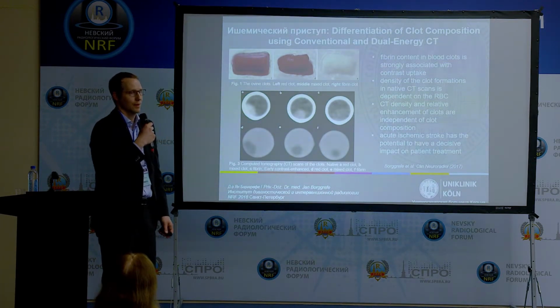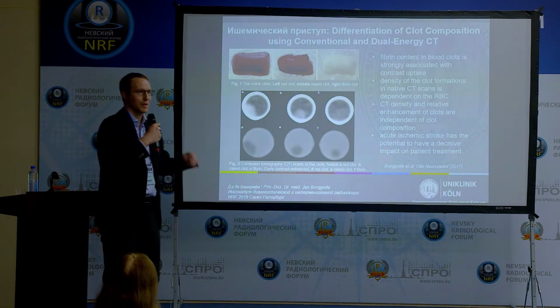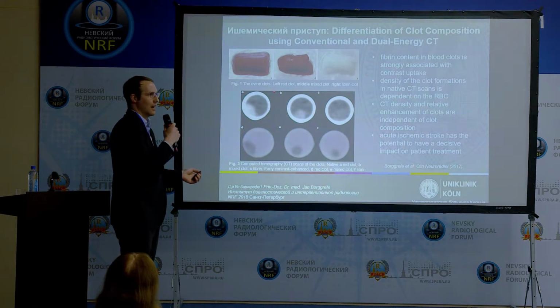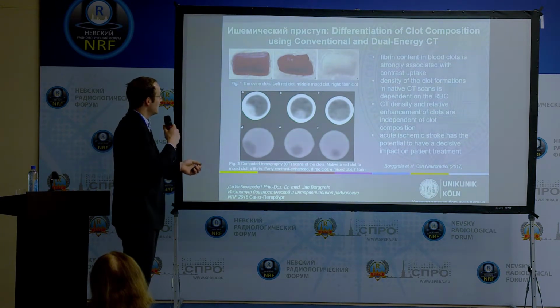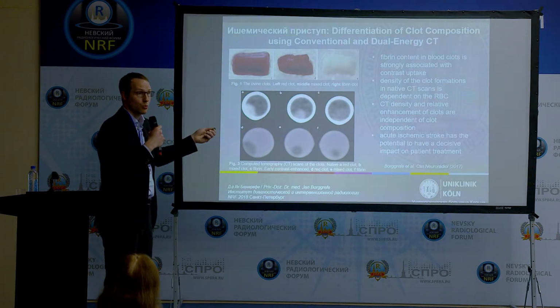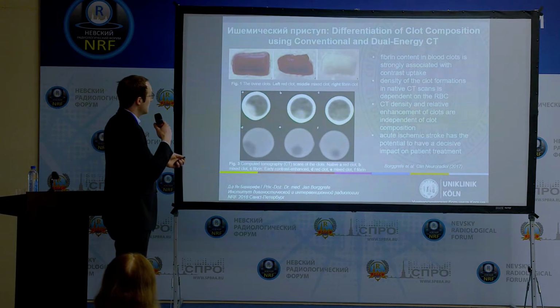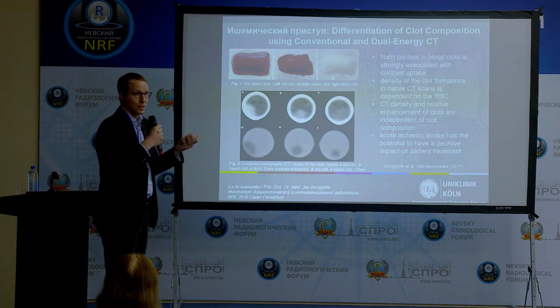I have a cooperation with a company that is producing blood clots. I found out when having dinner with them that they are producing blood clots in order to test their thrombectomy devices. And I thought it was very interesting to see these clots finally when I got them, because they have a defined histology. We know this is a white blood clot when you have a thrombus in the brain. These are the old ones that have been there for a few hours, because the erythrocytes are being washed out of the thrombi. These are the mixed ones, which are quite solid, and the fresh ones are really fluidy.